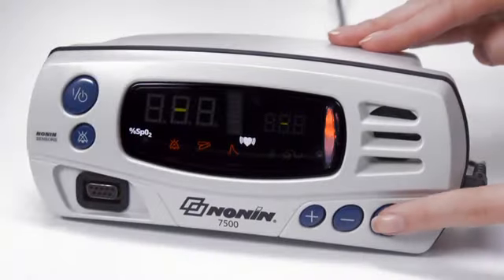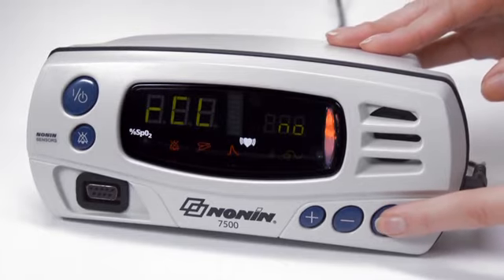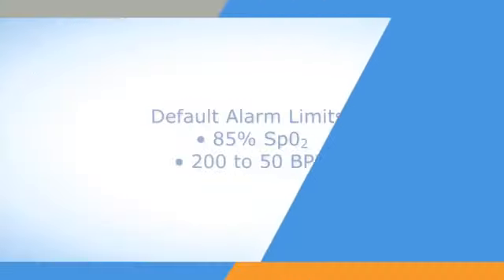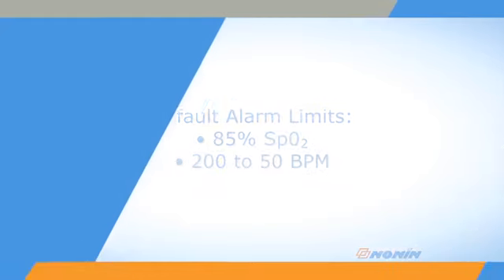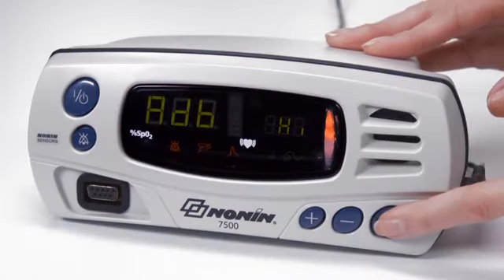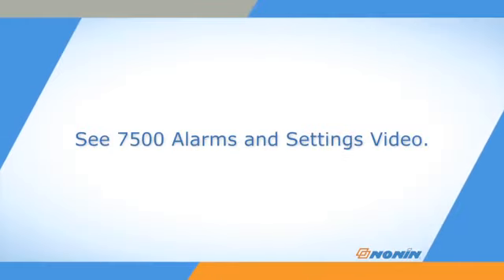It's recommended to set and check alarm limits and other oximeter settings prior to each patient use. The oximeter comes with a default low alarm setting of 85% SpO2, a high pulse rate of 200 beats per minute, and a low pulse rate of 50 beats per minute. These may be customized in the setup mode explained in the alarms and settings video for this oximeter.